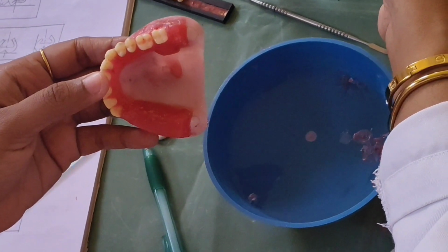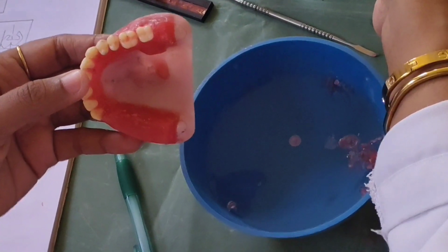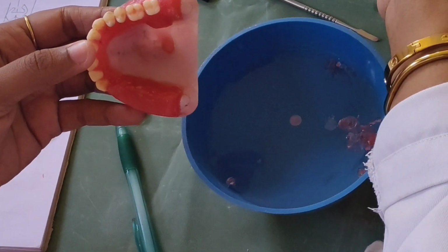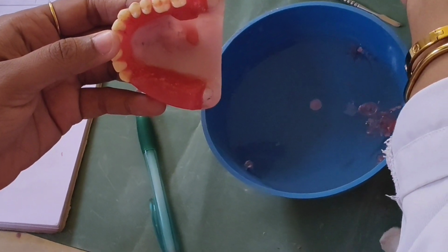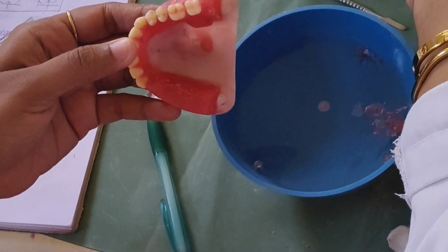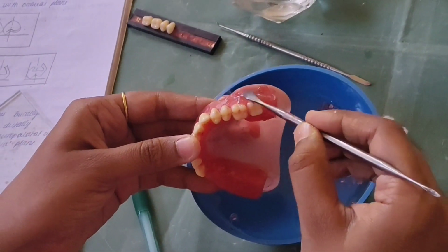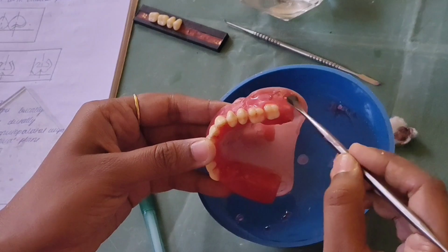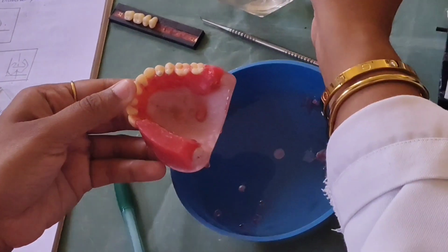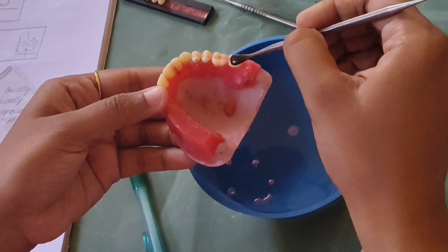So what you are doing now: buccally, what you are seeing, what should be the glass plate relation, which cusp where, that you have to write in short and draw the diagram. So first you make columns during the exam and you draw the diagrams or write whatever you feel. But diagrams are very important. Even if you don't have sufficient time and you are just writing, make sure you have drawn the diagrams, so that we get the idea of what you have understood.